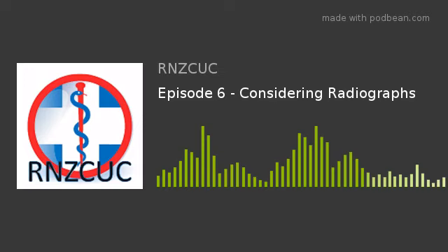But I guess what you're saying in a number of these is that if the clinical suspicion is there, then referring on for further imaging is probably in the patient's better interest. It's another one of those scenarios where a positive test is pretty good, but a negative test isn't.